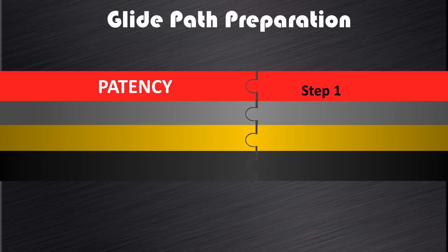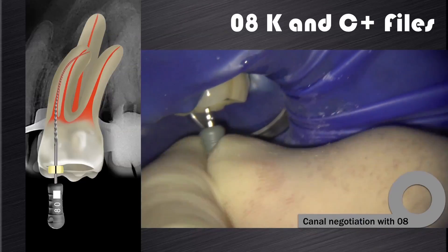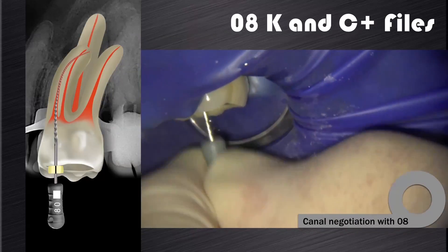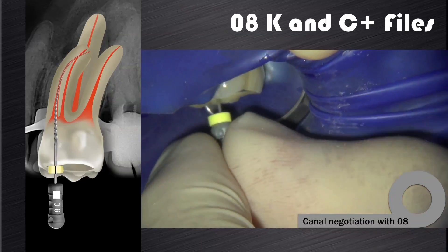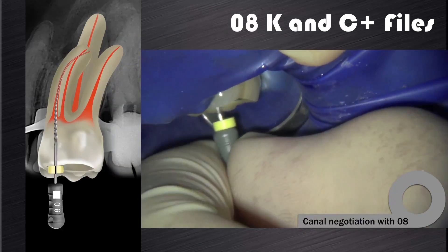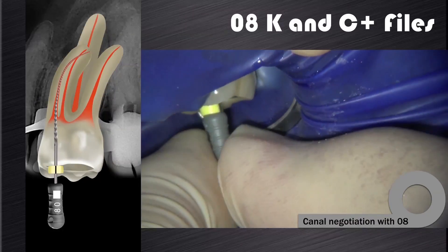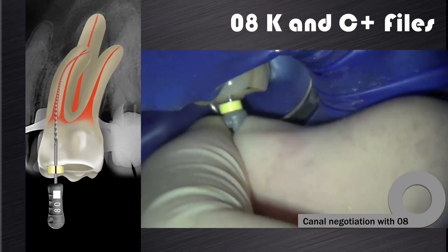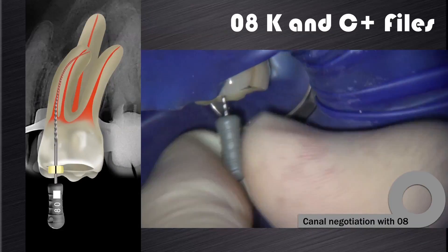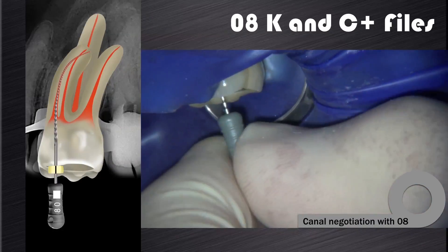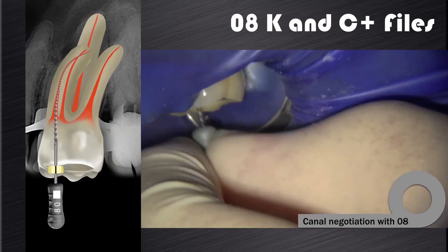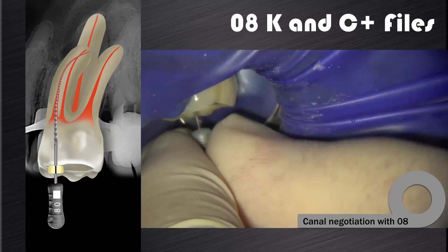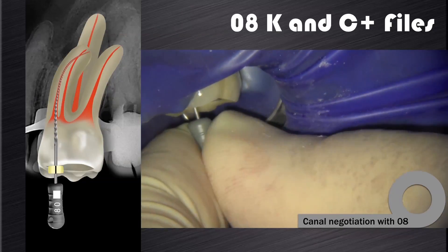Canal patency is the first step. I use a combination of 08 C-plus and 08 K files to negotiate the canals to patency. Some cases are easy and some cases are very, very difficult. The inability to create patency to full working length is often the reason why we see so many poorly prepared and obturated root canal systems. In this video clip you can see that I've just achieved patency.